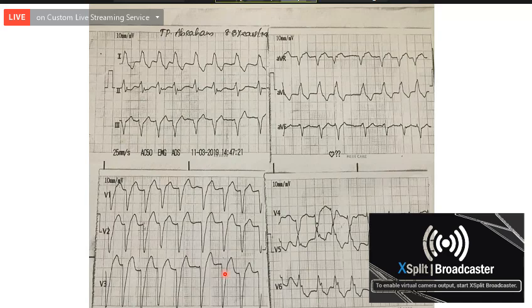Are you able to make out P waves? P waves. No, sir. Atrial fibrillation with pre-existing LBBB. Very good. Atrial fibrillation, because you are not able to distinctly see P waves. The QRS is irregular, and there is a broad QRS complex. So the patient is having atrial fibrillation with pre-existing left bundle branch block. So it's atrial fibrillation in a patient with pre-existing left bundle branch block.